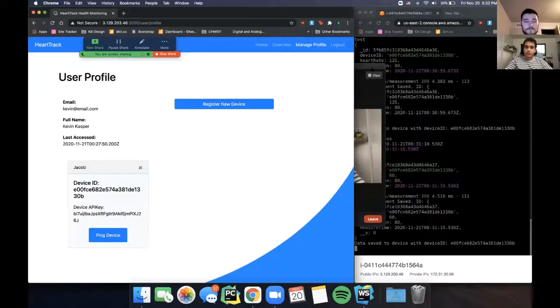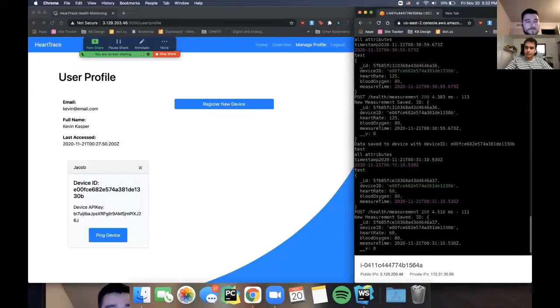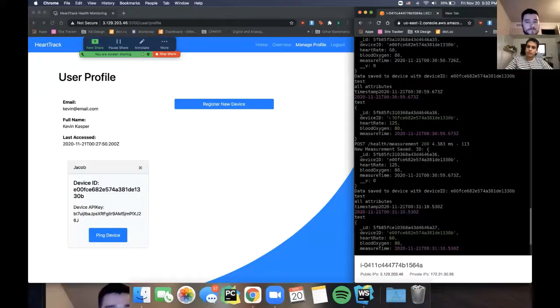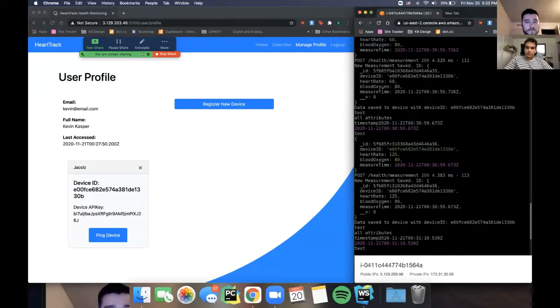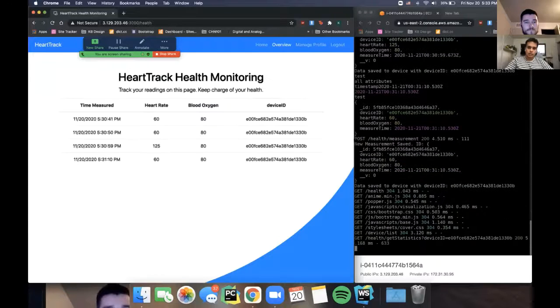Okay, welcome back. I'm going to show you that in our monitor, we have received those readings from the device. They are attached to the device ID. We have the heart rate and the blood oxygen, as well as the time that we received the measurement. If we go back to our user profile, we can visit the overview page, and you will see all of the measurements that we have received so far. A heart rate at 60, a brief jump to 125, as well as the device that sent them over.